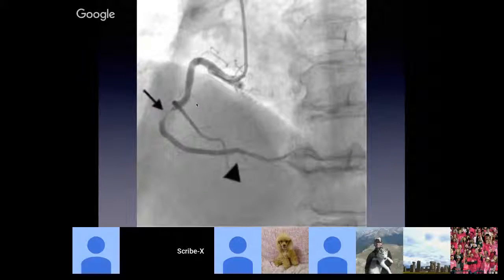So this is what it looks like on an angiogram. So this is where the cardiologist got out of bed at 2 a.m., drove his Mercedes to the hospital and cannulated this person's aorta and drove this cannula up to the, let's say this is the right coronary artery because it looks like the right side of the body. You can tell this is an angiogram. This is a fluoroscopy. This is basically an X-ray. You can see the vertebral bones here. So we're peering basically through the heart, and he's squirted dye.